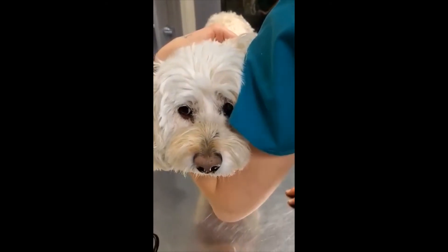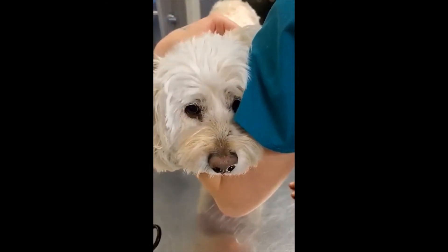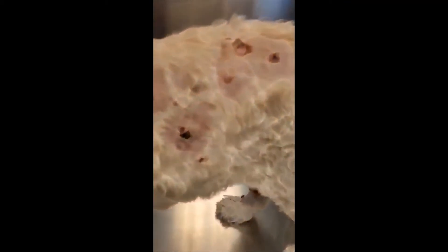Hello, this is Roxy, a 12-plus-or-minus-year-old mixed-breed Westie, who was presented for multiple cutaneous papillomas.